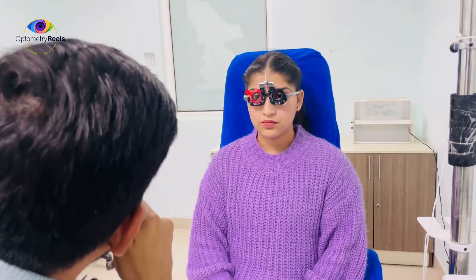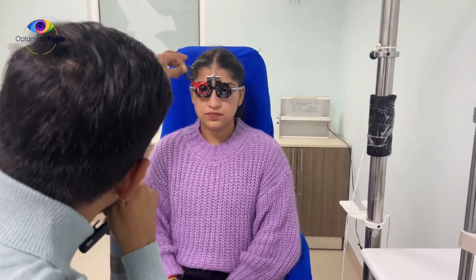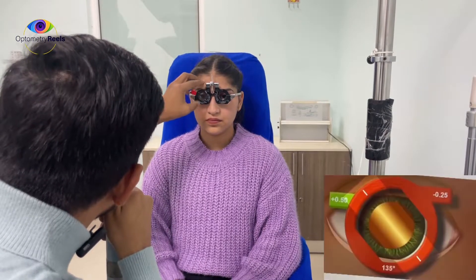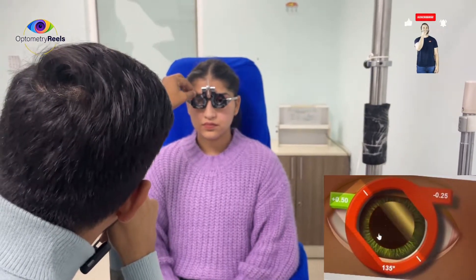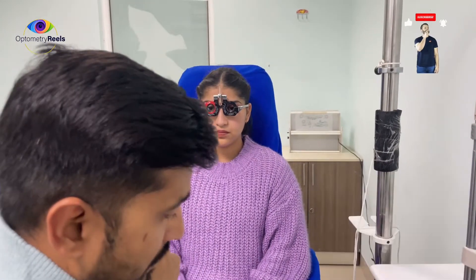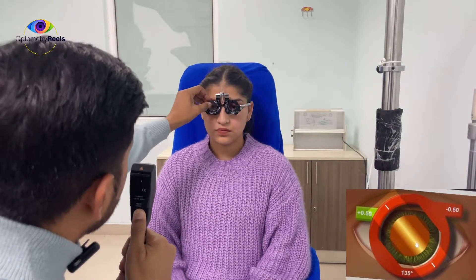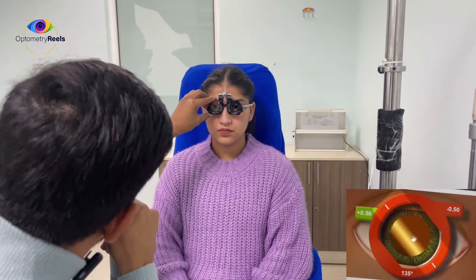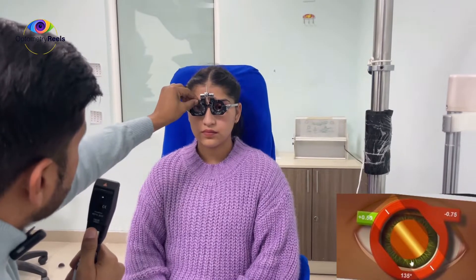So now it's time for me to neutralize the 135 meridian. For 135 I am going to use minus lenses because it is against movement. I still can see some movement, so I will keep on increasing the power of the cylinder until it is getting neutral.